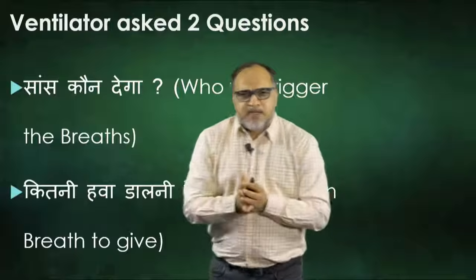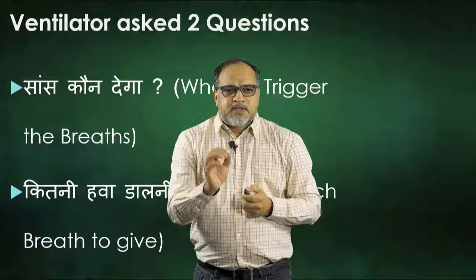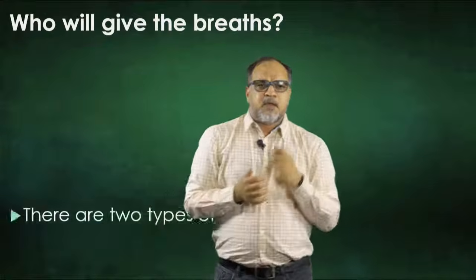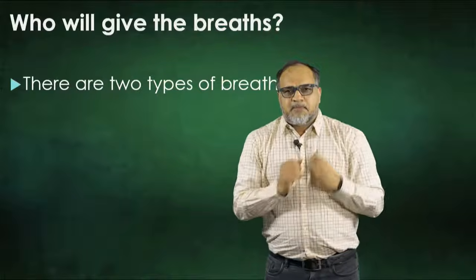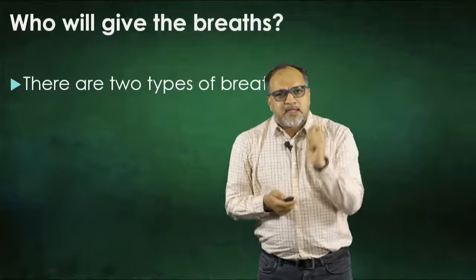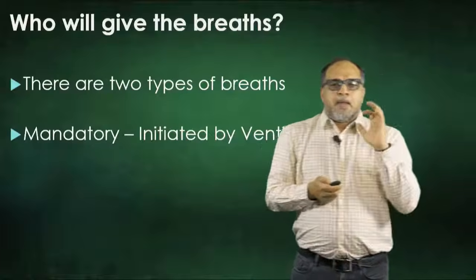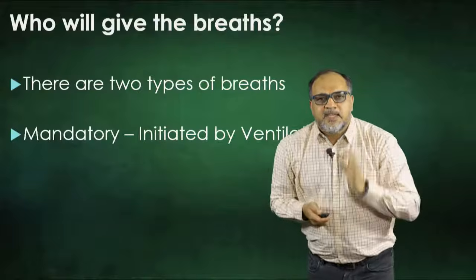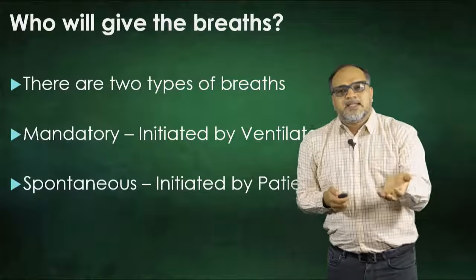Whenever you put a patient on a ventilator, like I said, the ventilator is a 10th fail boy, he will ask you two questions. First is, सांस कौन देगा? What does it mean? There are two types of breaths. Whenever we ventilate a patient, there are two types of breaths. One is called the mandatory breath and the other one is called spontaneous breath or supported breath. Mandatory means the breath that is initiated by the ventilator, and supported or spontaneous is initiated by the patient.